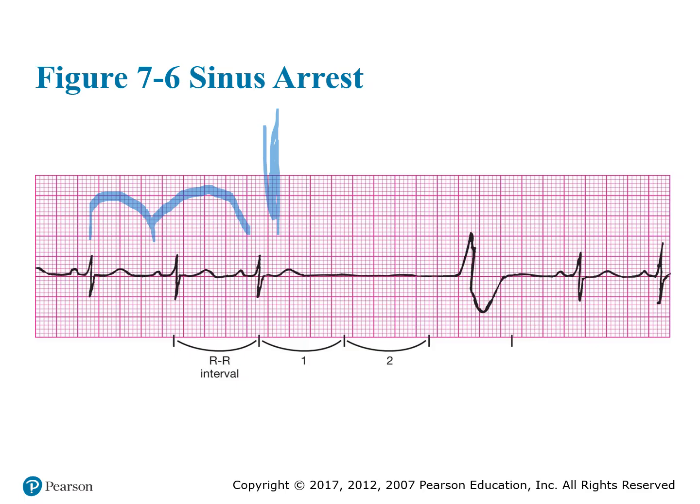Everybody's good. Then from here to here, the heart literally stops. It's not beating. It's not circulating blood. Not doing anything. Well, after it stops, like I said, the heart has two fail-safe mechanisms to make the heart beat, right? So once it determines it stopped, this is how long it takes. This particular one, this is how long it took the heart to realize that the sinus node had stopped beating. So then something lower down in the heart kicks in, and this is the backup generator, right? This is the fail-safe.